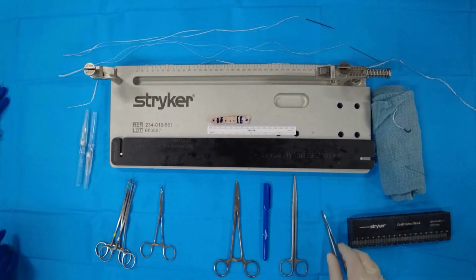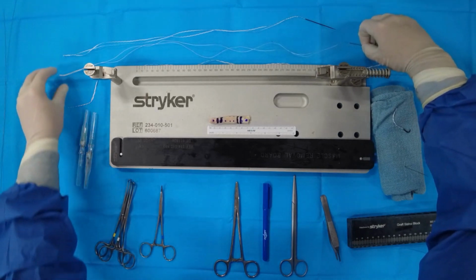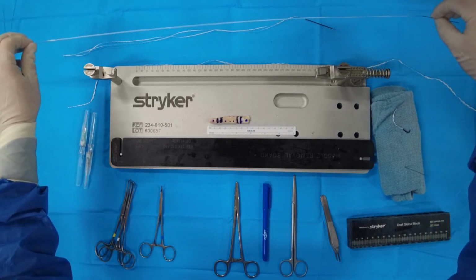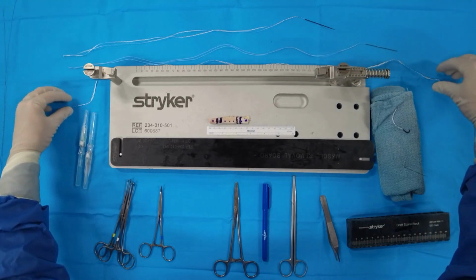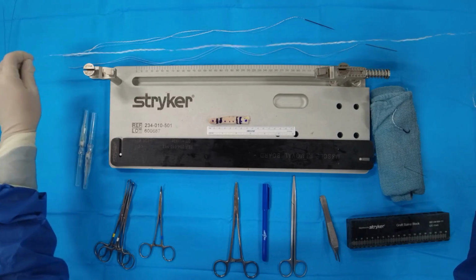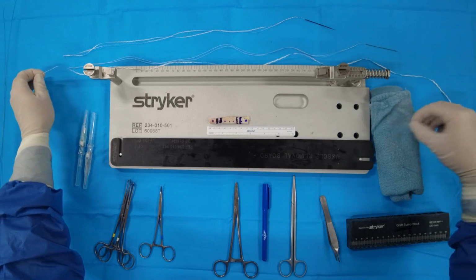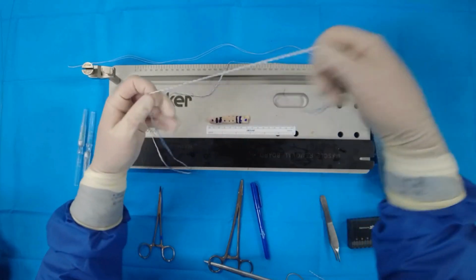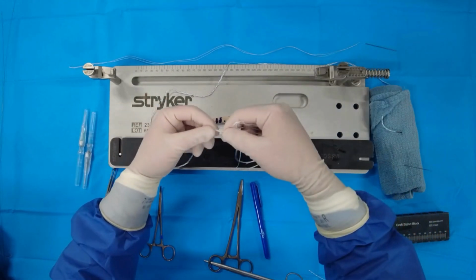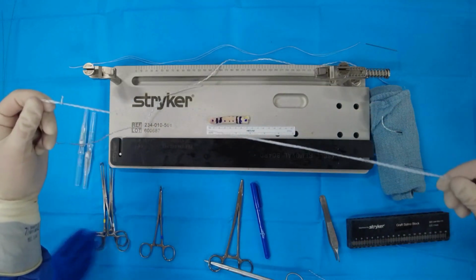And so as we set this graft, I'm going to show you some different materials that you can use. Now, there are commercially available loop sutures that have a tape swedged to the end on them already. Now, you can make this construct yourself if you like. You can just take a tape and a loop suture. And I'll demonstrate this for the technique, but what you can do is just put a luggage tag through the swedge of a tape suture and make your own looped suture tape construct if you'd like.